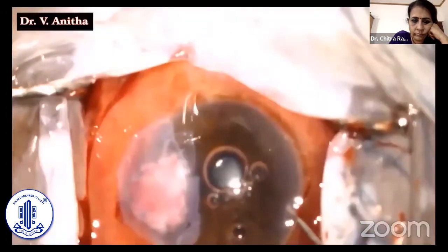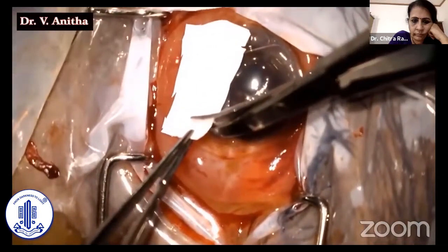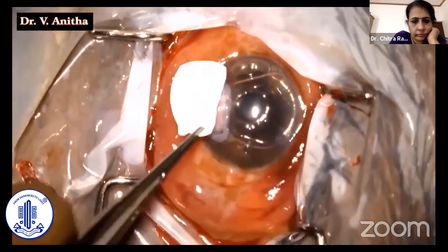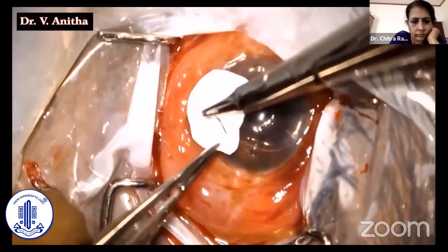On attempting anterior chamber reformation, the fluid leaked through the gap. Hence we thought of using Gore-Tex. Gore-Tex is an expanded polytetrafluoroethylene (ePTFE) material. It can act as an adjuvant and give mechanical support for the Tenon's in sealing the perforation.